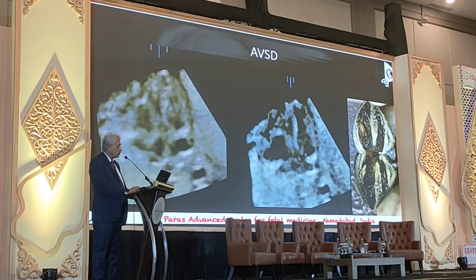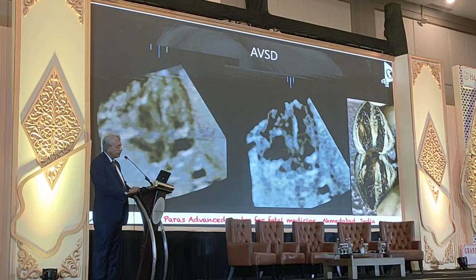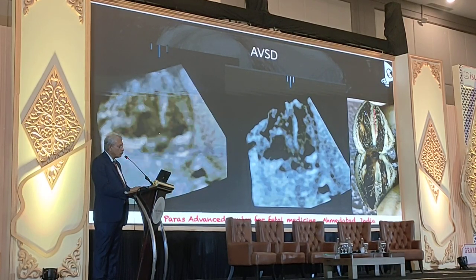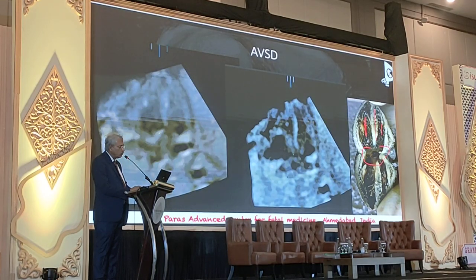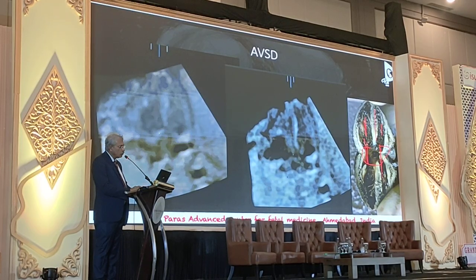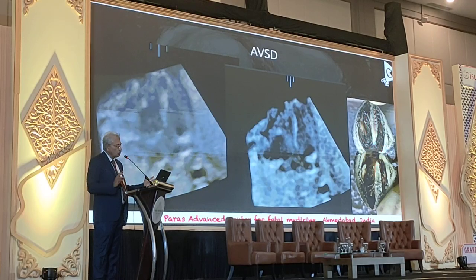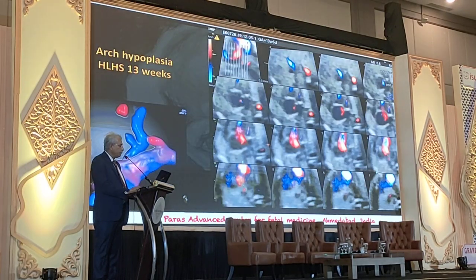And this was, again, one more case of atrioventricular septal defect which was identified. Look at this. The pathology is like this. You have an interventricular septum which is good, one chamber well developed, but look at this region. You have to have one opening as a tricuspid valve, one as a mitral valve, and this should be the crux, with a complete normal interventricular septum. But the entire system is one single opening, and those things you can identify.